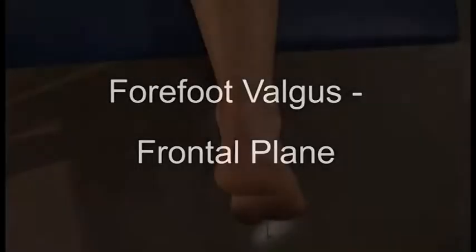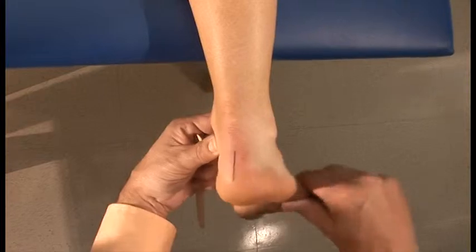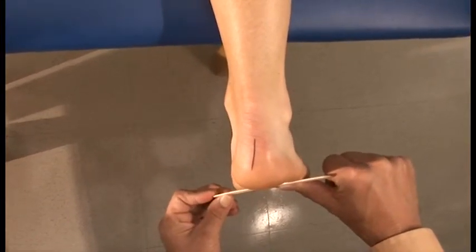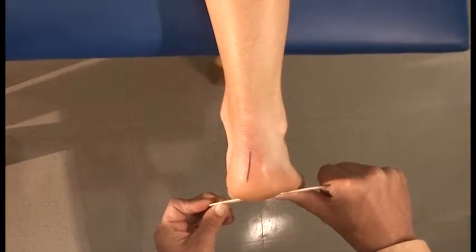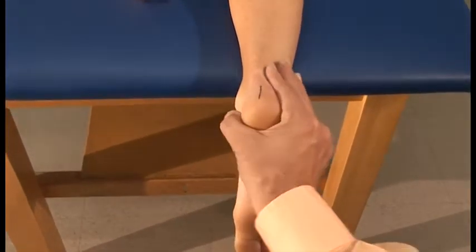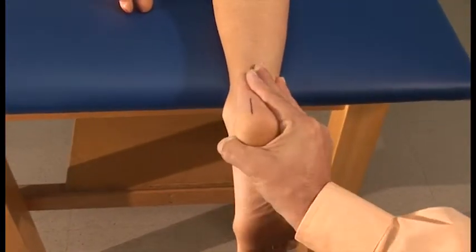Finally, in the frontal plane, we can see that if we place the subtalar joint in its neutral position and then place a marker across the forefoot, it is in an everted position relative to the heel bisection. Another important component of the examination is to make sure that the patient has adequate calcaneal eversion for pronation to occur. Our next test will be for arch mobility.